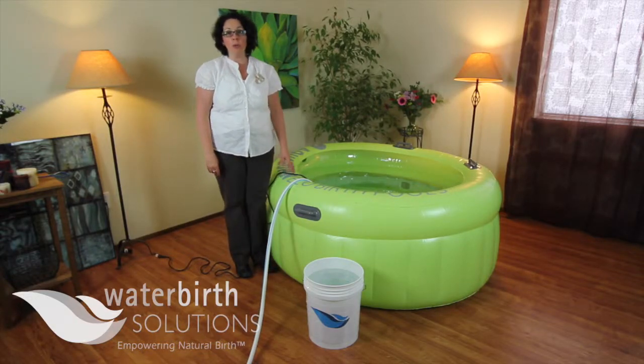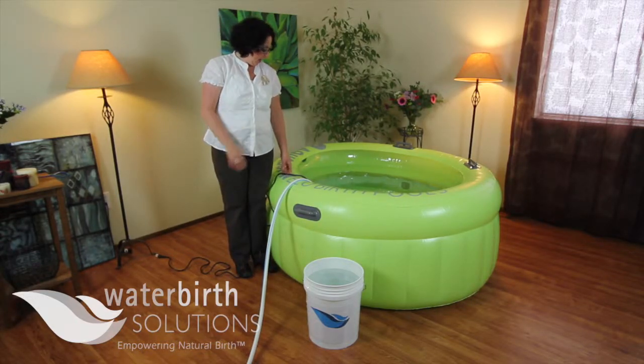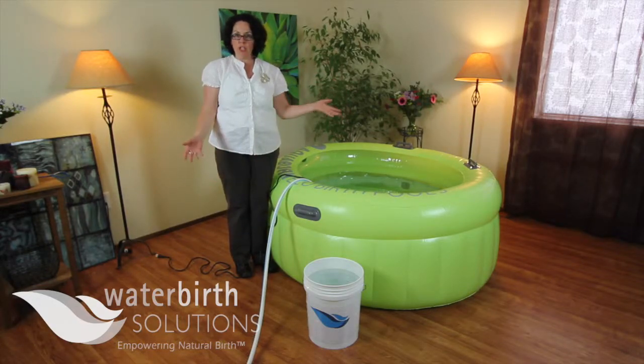Hi, this is Marla Althaus with waterbirthsolutions.com. I am here today to talk about what to do with your drain pump when you're done with it.